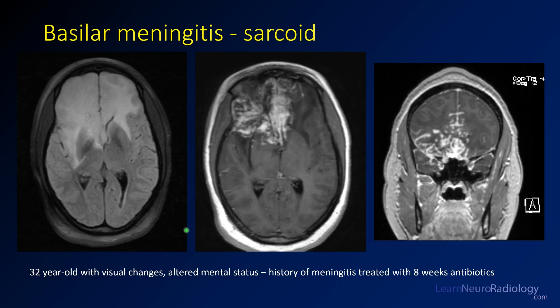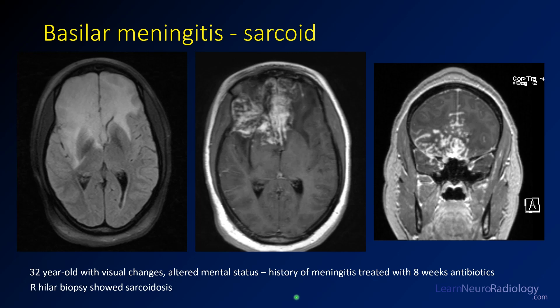Here is a bifrontal example. On FLAIR there is diffuse signal abnormality of the frontal lobes, worse on the right. On post-contrast imaging there is avid enhancement in the leptomeningeal spaces and parenchyma. The coronal post-contrast image shows sulciform enhancement interdigitating into the sulci along with parenchymal nodules. This was a 32-year-old with visual changes and altered mental status who had a history of treated meningitis. This patient turned out to have sarcoidosis, confirmed on a right hilar biopsy of lung nodes.